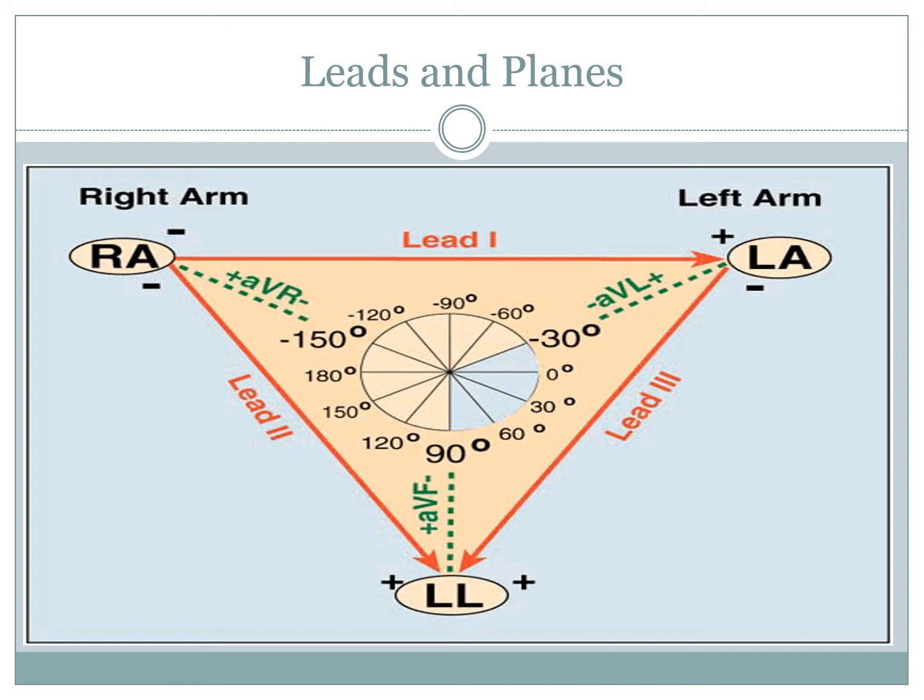So you get your standard limb leads, your augmented leads, and your precordial leads. Now most monitoring systems will utilize these 3 leads. The initial 6 leads are obviously 1, 2, 3, AVR, AVL, and AVF. And these are termed limb leads because they derive from the electrodes that are attached to the arms and legs.